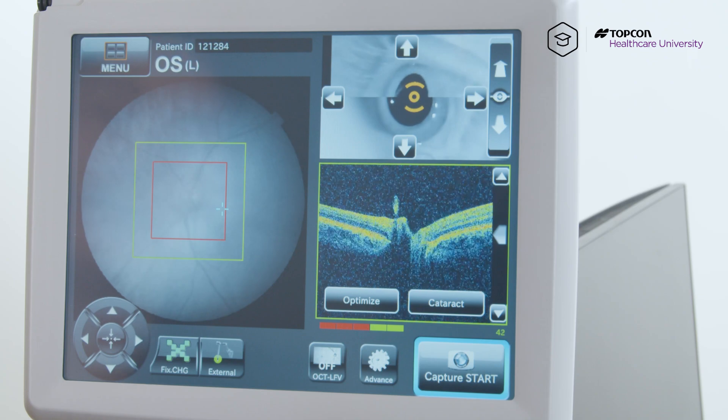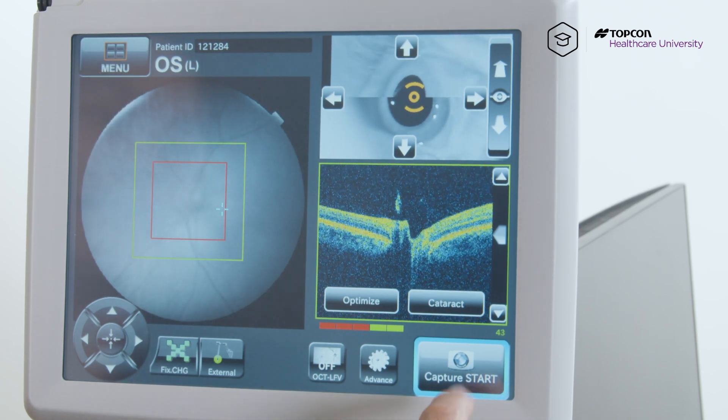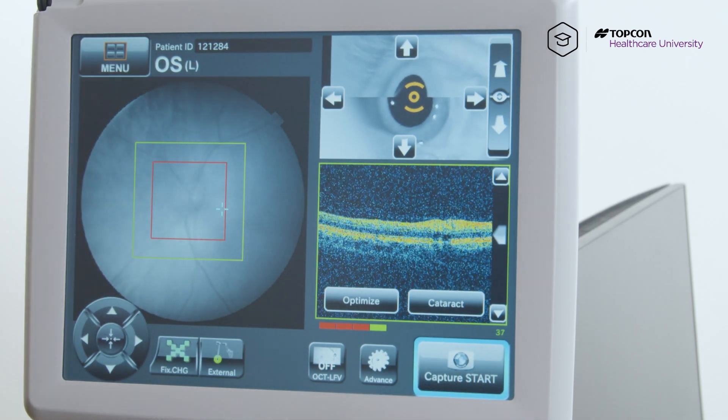Let the patient know to keep looking there and blink once. Hold it there — don't blink, don't move. Hit capture start.